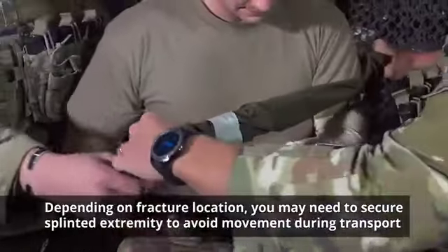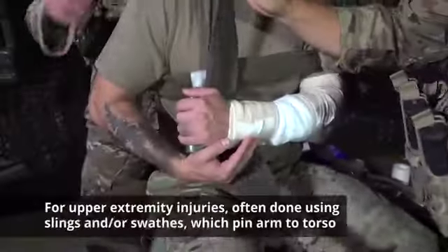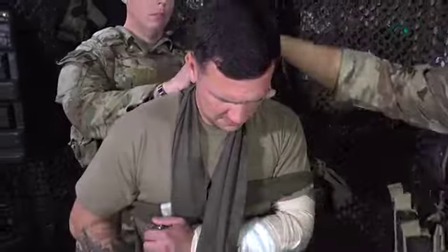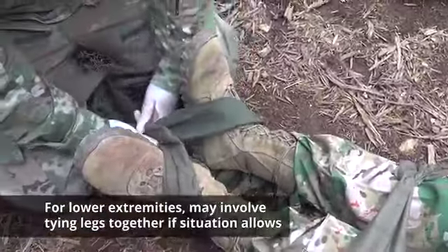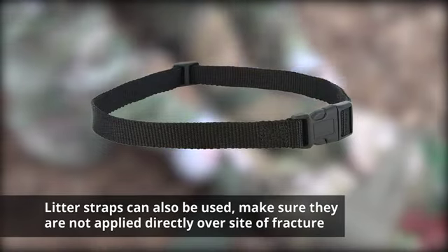Depending on the fracture location, you may want or need to secure the splinted extremity to avoid movement during transport. For upper extremity injuries, this is often done using slings and/or swaths, which pin the arm to the torso. For lower extremities, it may involve tying the legs together if the situation allows. Litter straps can also perform this function, but make sure that they are not applied directly over the site of the fracture.